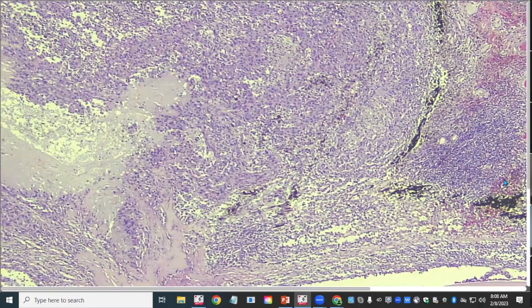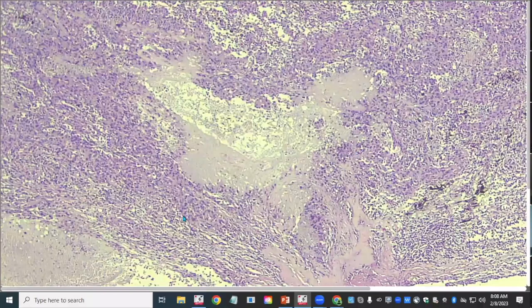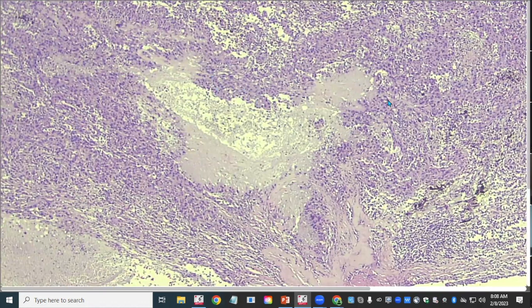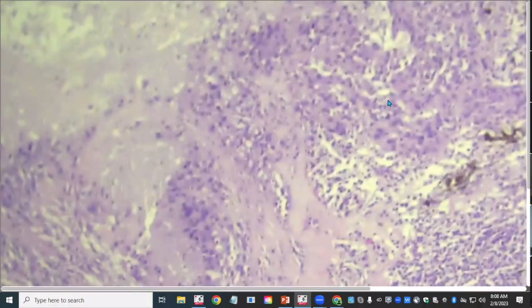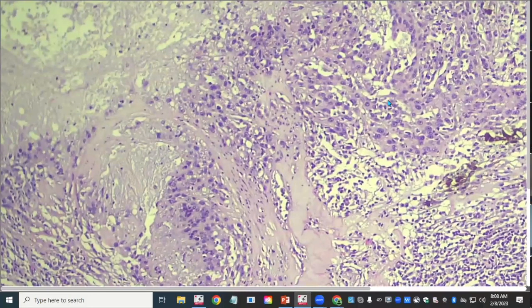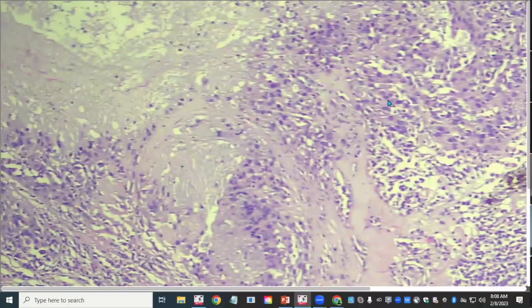In some areas the cells form bundles, in others they're in completely disorganized sheets with no discernible shape. At higher magnification, the cells show variable morphology.